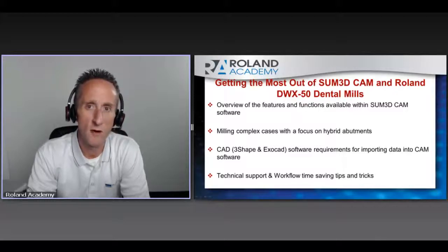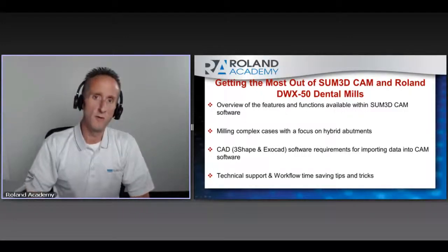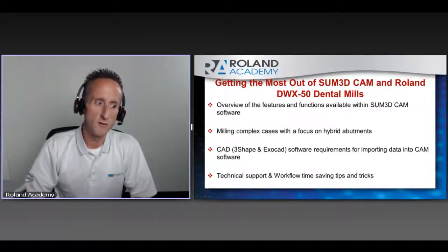Today we're going to have a partner webinar with Mike Webb from SIM Systems, or SUM3D as most of you know. This one is going to be covering getting the most out of your SUM3D CAM and the Roland DWX50. So today we're going to talk about 4 different topics. The first one is going to be an overview and features and functions available with the SUM3D CAM software.